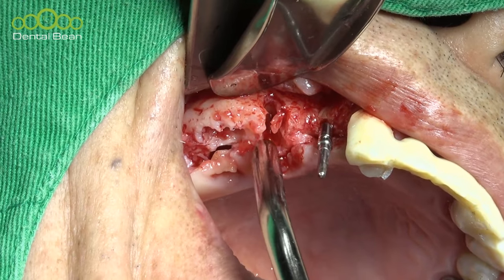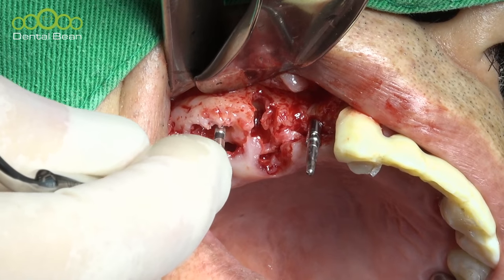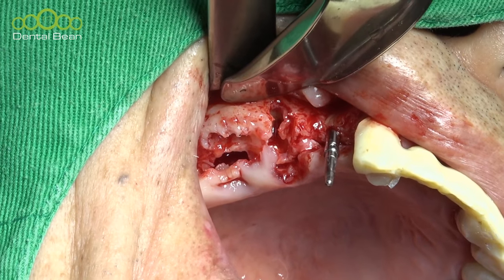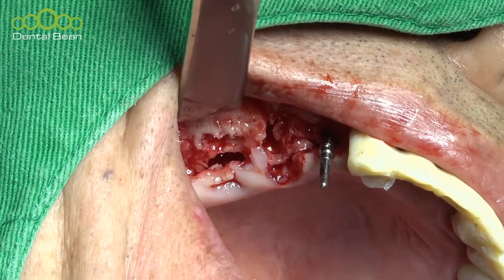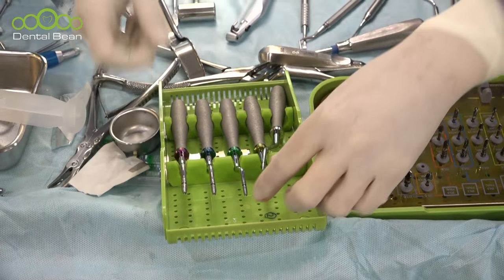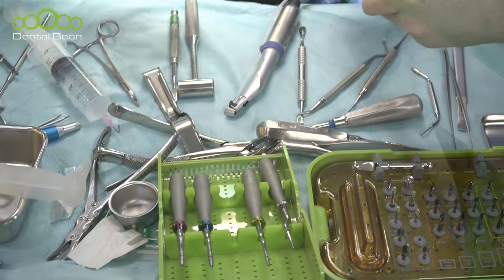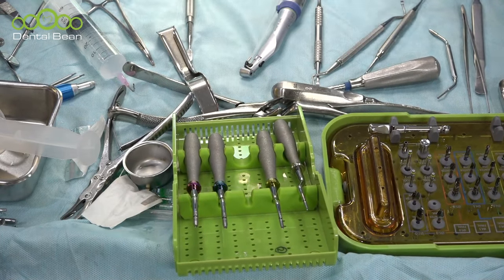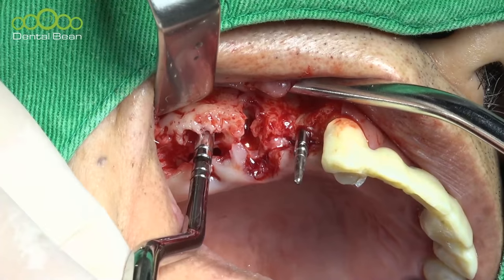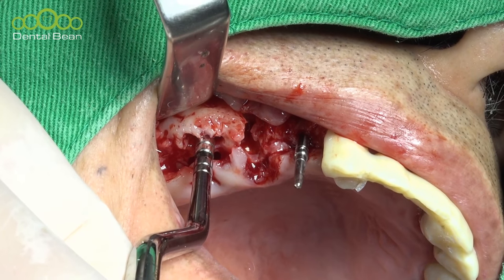Okay, I want to check whether there is sinus floor penetration or not. Okay, osteotome, please. 3.5. 3.8. One malleting, 1mm insertion. Very soft force.